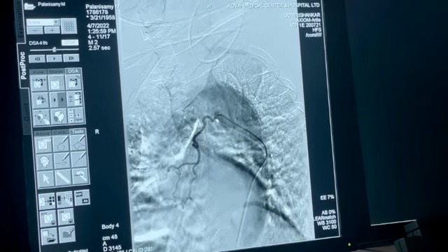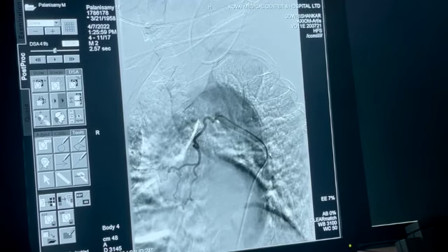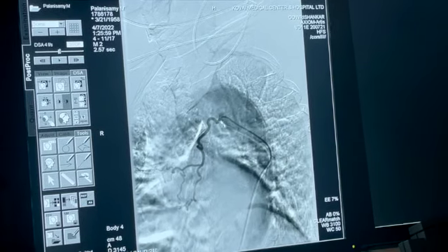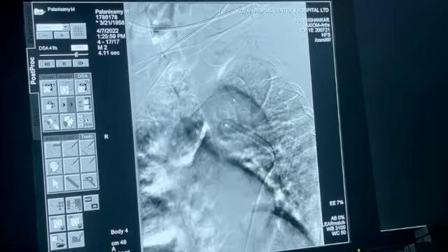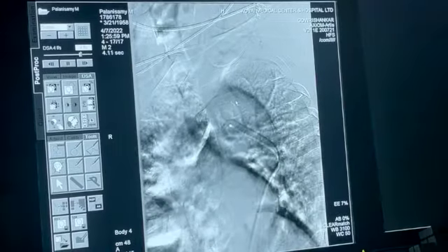And that's why we said the Judkins left works well. The secondary curve is pushing from the outer curve of the aorta, allowing it to go. And now that you have profiled the origin, you enter this and you successfully treat it. So after that, of course, treatment is not difficult. As you know, it is a very, very standard treatment that you would do, right?